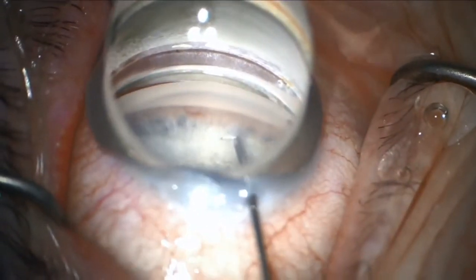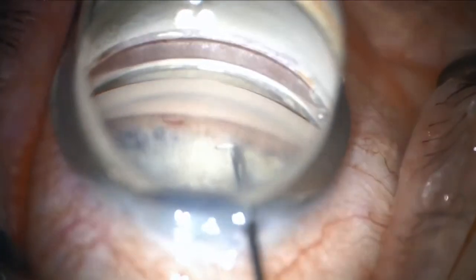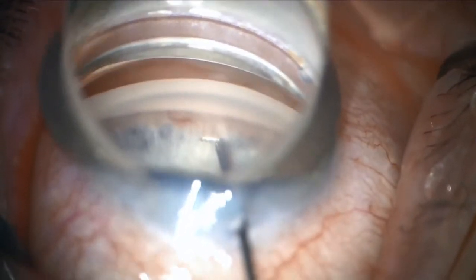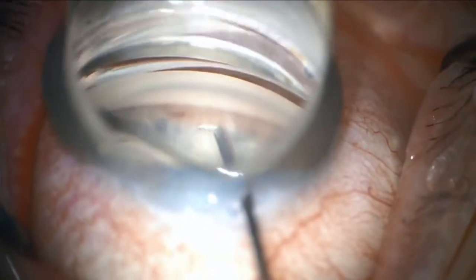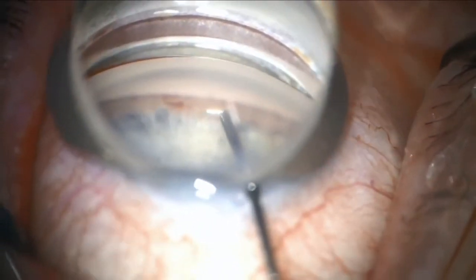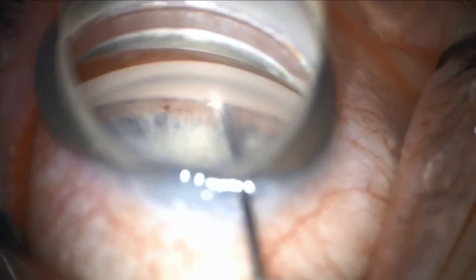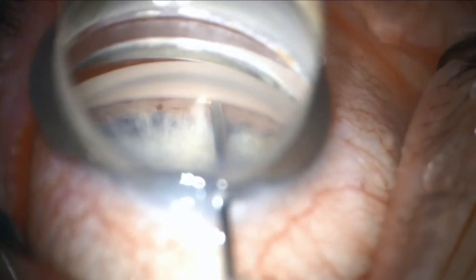Here we have the eye stent back on there. We're looking across at the trabecular meshwork, looking really to insert the eye stent in about the anterior one-third of the trabecular meshwork. We're looking for some heme that's collected there in Schlem's canal and some collector channels.